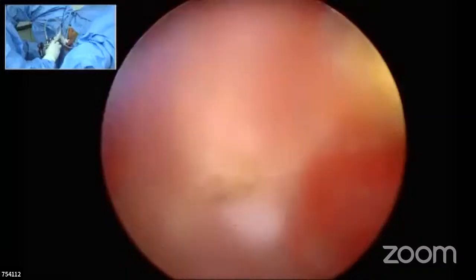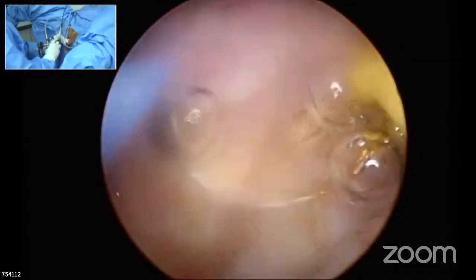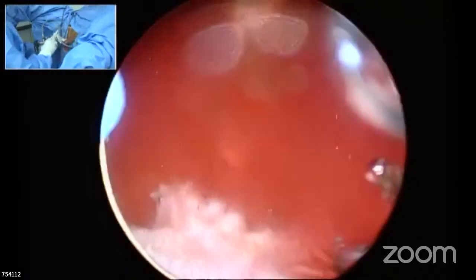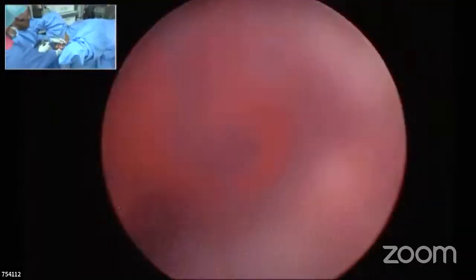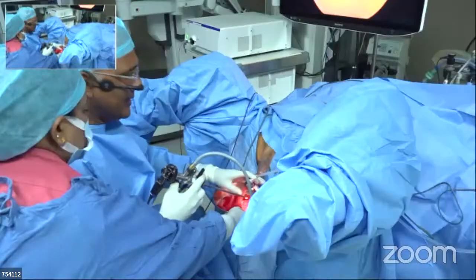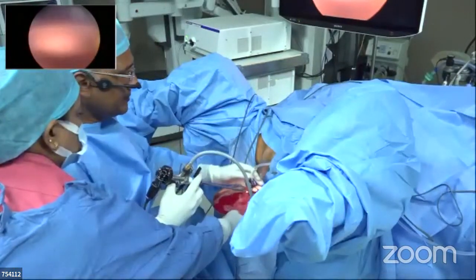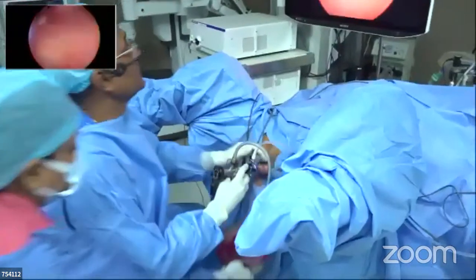But of late, the whole concept has changed and complete resection has become the mainstay of any TUR, not just making him pass urine. So we are looking at resecting right up to the capsule and making a better resection. That's all. I feel the difference between Burns at that time and the Nesbitt later is because of better instrumentation, camera, etc. Burns never had a camera. Nesbitt had a camera, so the whole thing is different. What do you say, sir? Yes. Am I right with that?